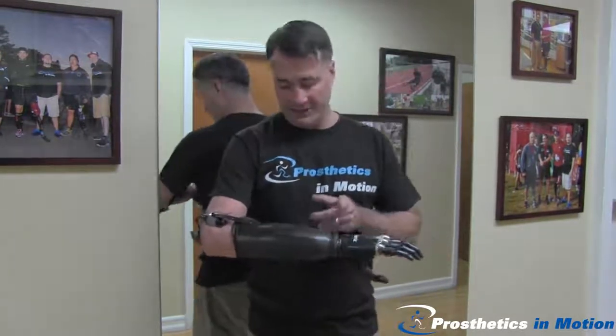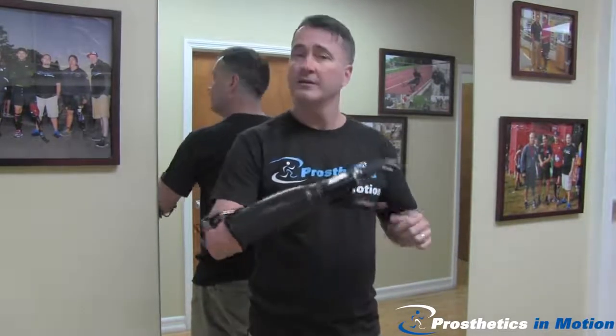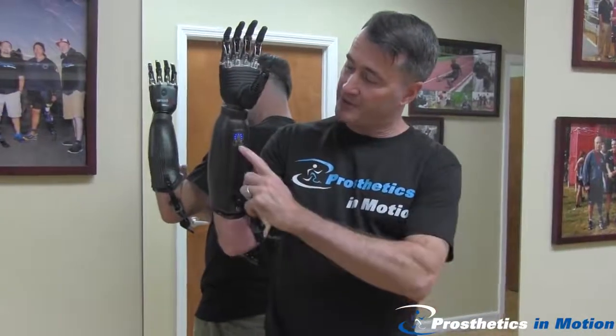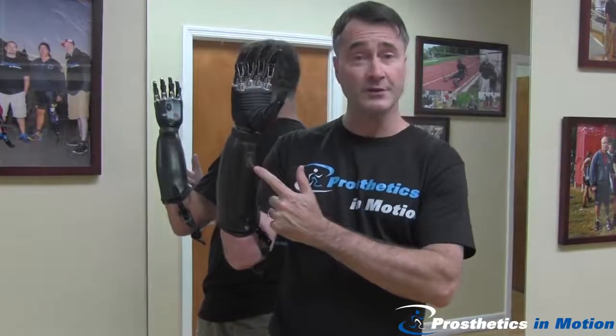The forearm shell is a carbon fiber outer layer with a flexible inner socket — completely comfortable, a perfect intimate fit — and a great little battery switch on the side that even gives me an indication about how much battery life is still available.